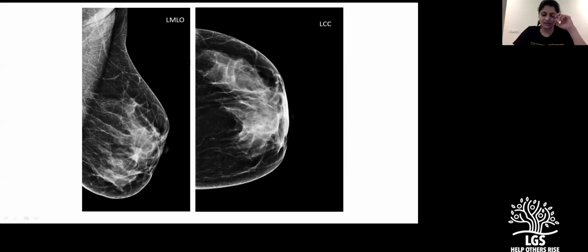I have one query, Dr. Vimla. So you were saying that you wouldn't advise a wide local excision on this if you see calcium. I don't know how widely they do frozen section in the US. Because if you get a clear margin. They don't do frozen sections at all. Okay. But if we get a good margin on frozen section, then why not conserve the nipple?